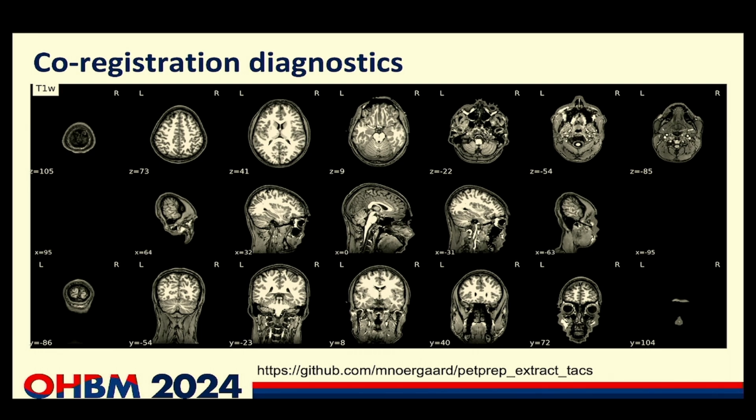On the quality side, currently nothing is added, and that's where there are some tools, at least on the MRI side, called MRIQC, and I know there are efforts to do that on all data on OpenNeuro. We're planning on doing something similar for the PET side. So if you would upload your data to OpenNeuro, we would run these diagnostics on it and basically put it back to OpenNeuro, so others can look into the quality of the data.